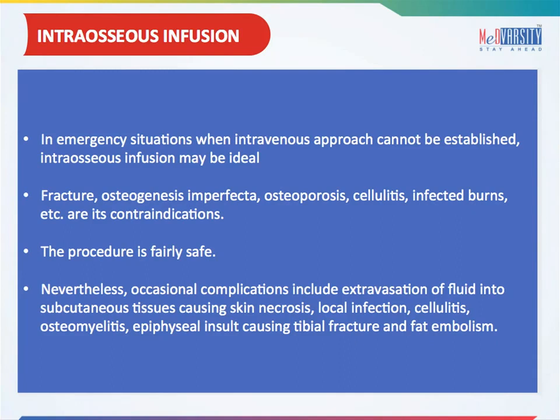Intraosseous infusion. In emergency situations when intravenous approach cannot be established, intraosseous infusion may be ideal. Fracture, osteogenesis imperfecta, osteoporosis, cellulitis, infected burns, etc. are its contraindications.